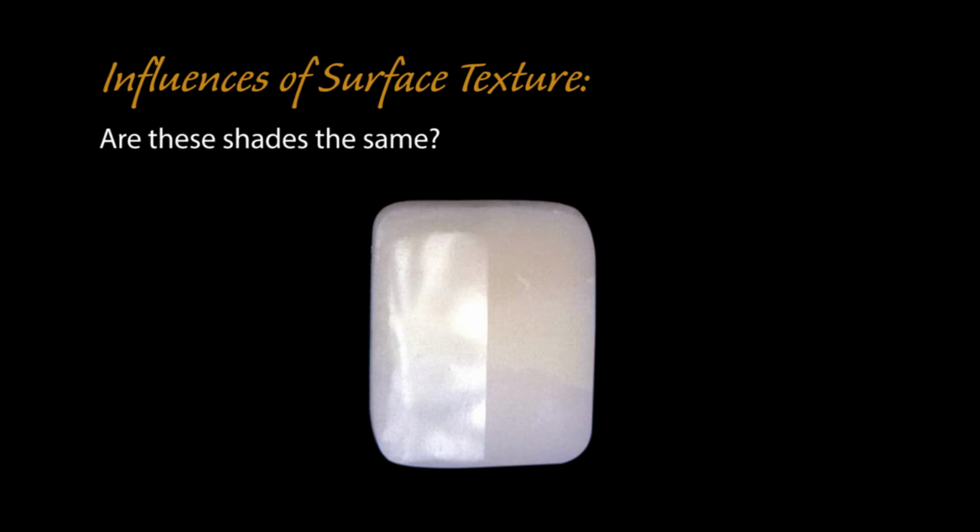It's the same color, but because of the reflectivity of the surface, it makes it look higher or brighter in value. So make sure you position the patient's head or the lighting source so that you don't get that reflection on the surface, so you see true color.